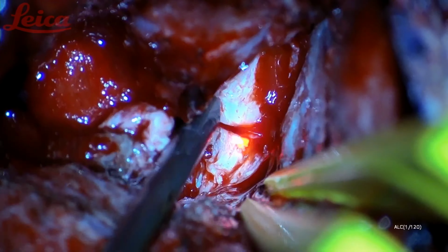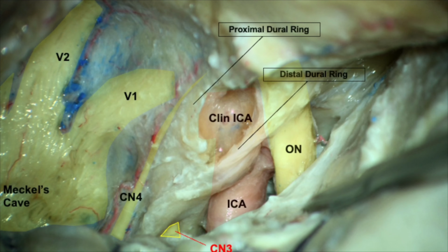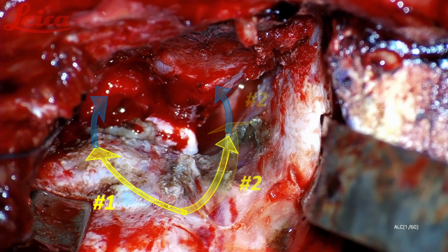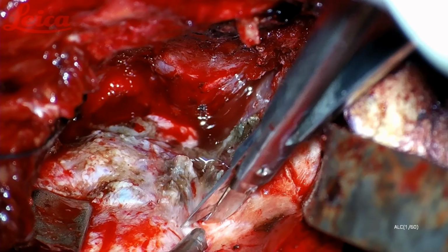Consequently, the exposures allow us to visualize the intracranial extradural compartment. Extradural decompression progresses with the opening of the dural convexity. The intradural compartment is entered through 2 curvilinear incisions at the temporal and at the frontal dura. Both initial cuts are followed anteriorly to achieve dural decompression of the paraclinoid structures.